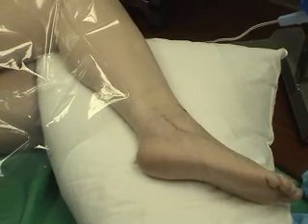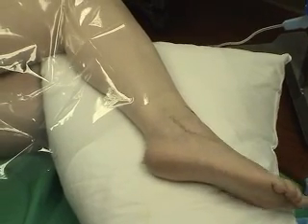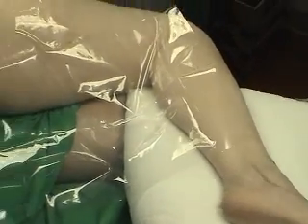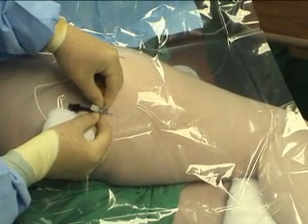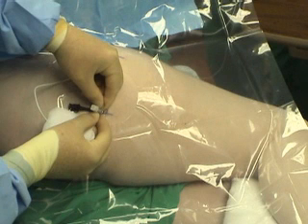Electrical stimulation of the sciatic nerve is indicated by a brisk plantar flexion motor response of the foot. More lateral stimulation of the sciatic nerve will result in eversion of the foot. The nerve stimulator output is now turned down, and brisk plantar or dorsiflexion of the foot at a nerve stimulator output setting of 0.3 to 0.5 milliamps indicates that the needle tip is placed in close proximity to the nerve.